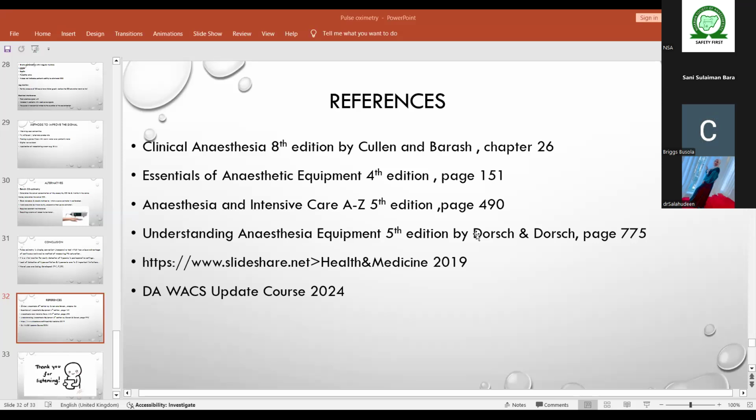But let me ask this before I give my closing remarks. What did I hear her talk about regarding the use of pulse oximeter in the burn patient and its place in the burn patient? Did I hear you talk about that? Okay, so please respond to that. When I talked about that, it can also be placed in the esophagus, like the Doppler, and it will use the reflected pulse oximetry to give us the reading. The advantage is that in burn patients, especially the burn periphery, at least there was a reading.